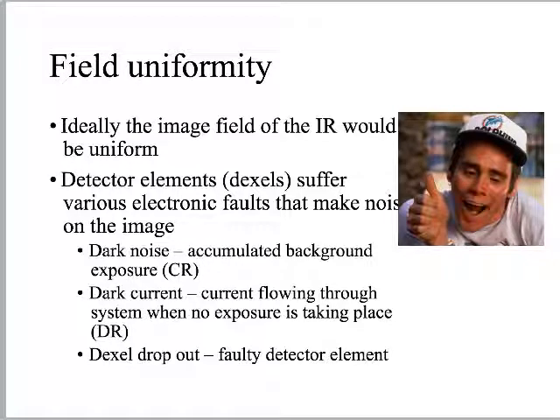And anytime you have electricity flowing through this complex array of detector elements, inevitably some current will flow from detector element to detector element, and it might receive that current as though it were X-ray transmission. It wasn't an X-ray transmission, it was just electricity, right? And we will call that dark current. So again, that could also create a blemish or like a pimple on the image.